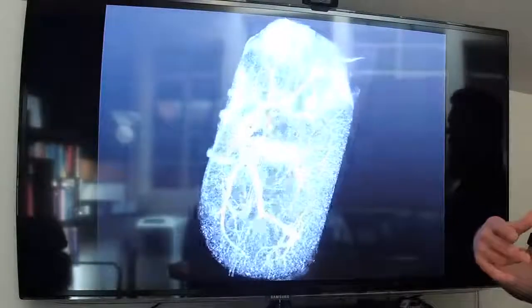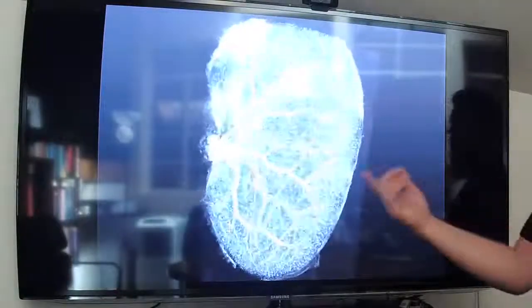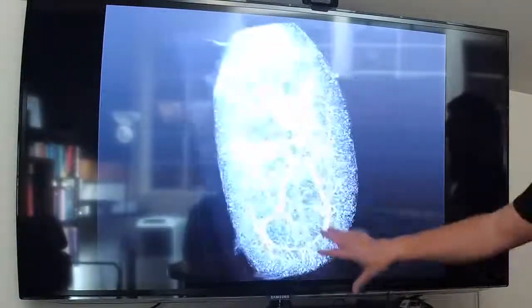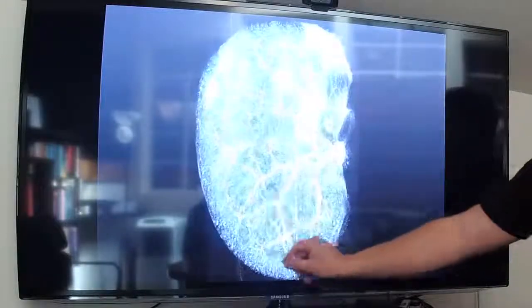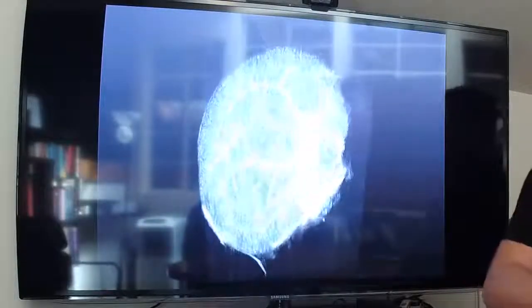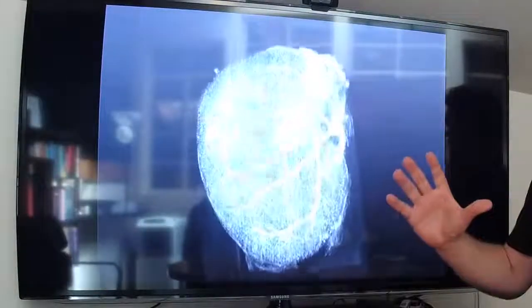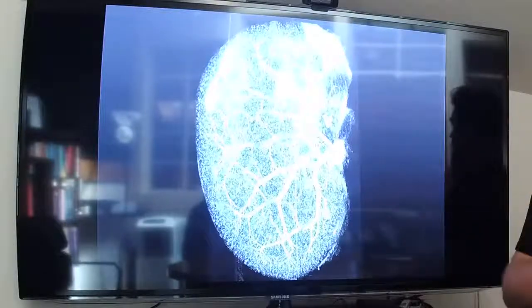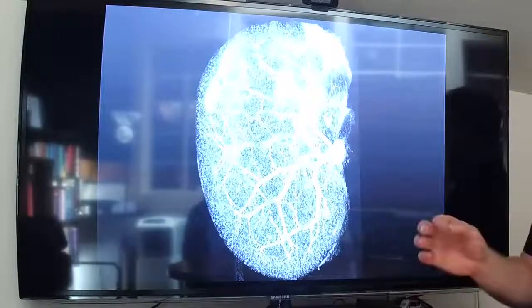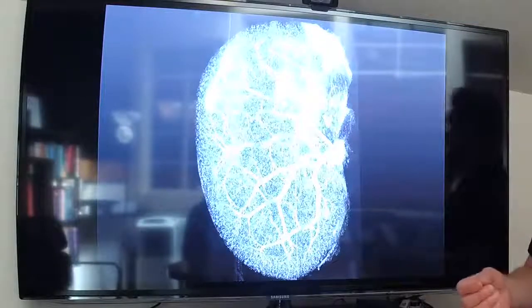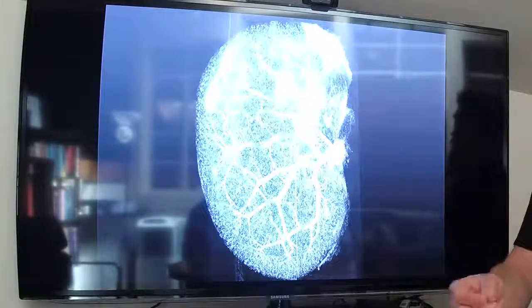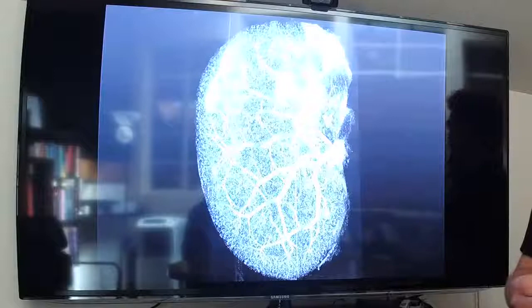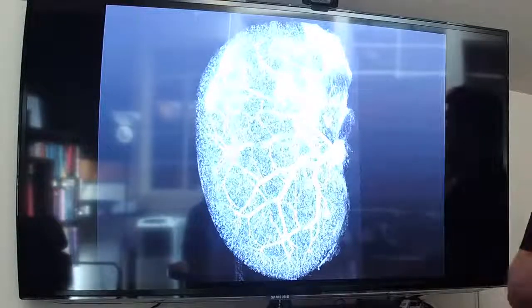And so this is that same kidney where we've downsampled it in order to fit it on the screen. We're rotating it. And so at this scale, you can see the major blood vessels in those smaller blobs. Those are the glomeruli of the kidney. I wanted to show this to you so you can see that we can fit a whole organ into the system.